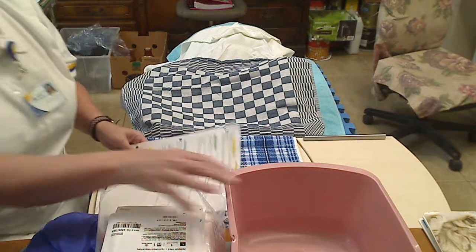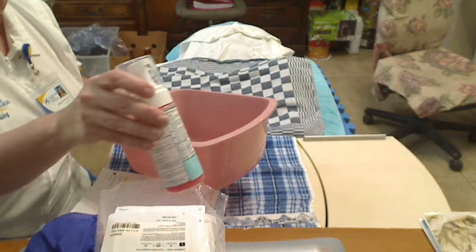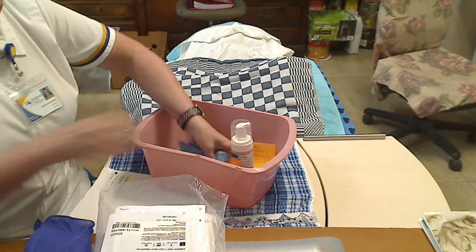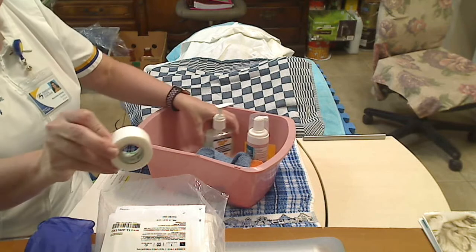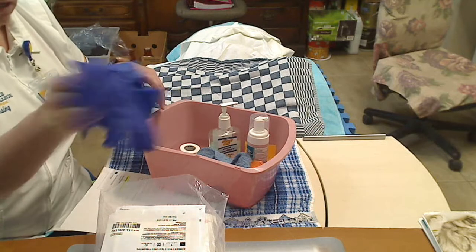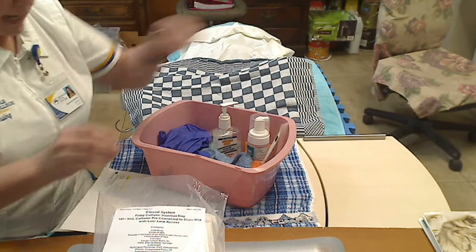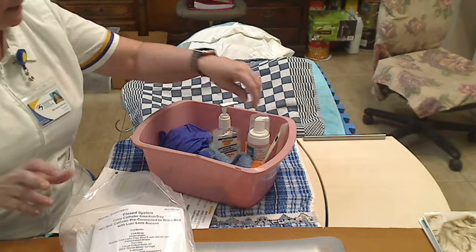First thing I'm going to do is I'm going to get a wash basin. I'm going to get my Hibiclens cleaner. I'm going to get a wash rag and a dry towel. I'm going to have my hand sanitizer, tape to secure, extra procedural gloves, just in case I break sterility, which I hope not, an extra pair of sterile gloves. And I will also have my indwelling catheter kit.